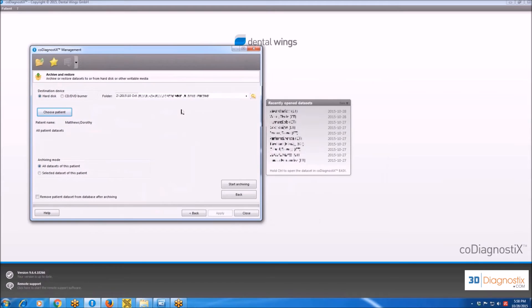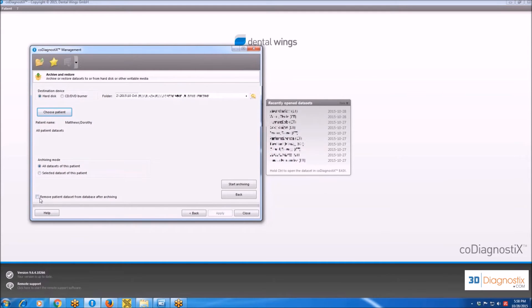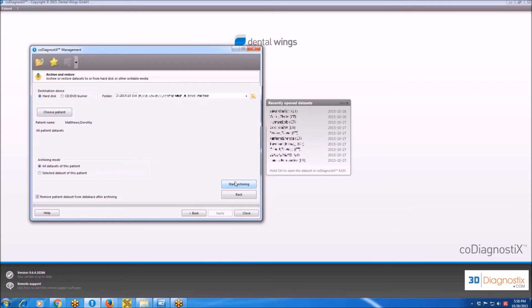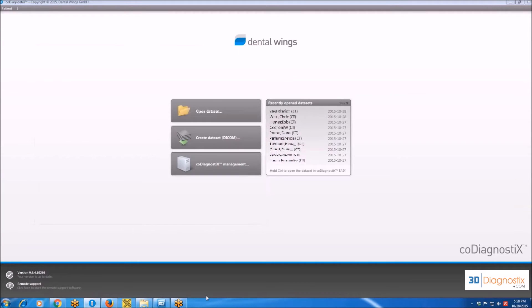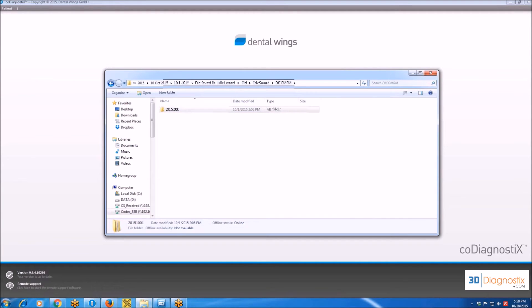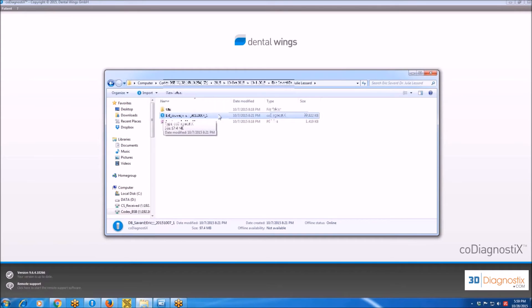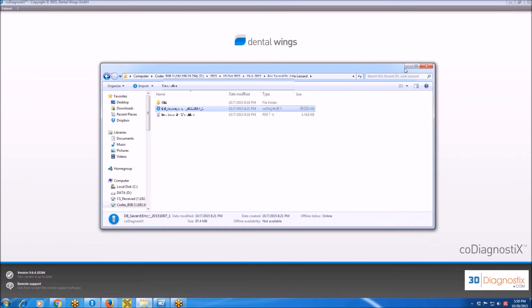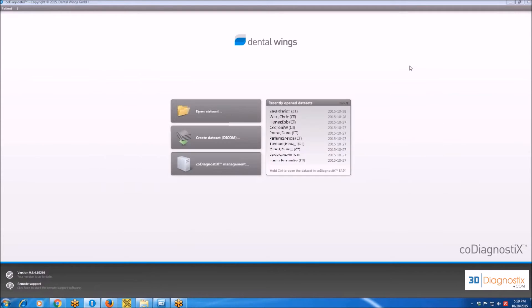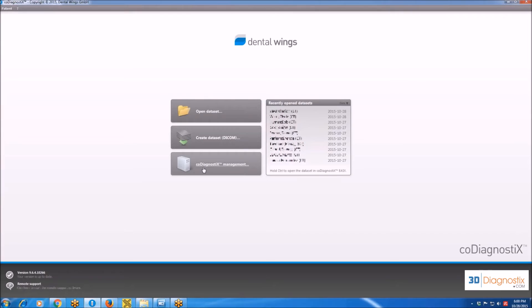Now we have two options: either save in a folder on the computer and keep it in the software, or, in order to remove this dataset from the software, just check this box at the bottom that says Remove Patient Dataset from the database after archiving, and then click Start Archiving. Once you archive to any folder, it's going to appear as a .caf or CAF file like this file over here: patient's name, Co-Diagnostics icon, and the extension of the file is .caf, which is Co-Diagnostics format. Let's say if you want to use the software on another computer, but you don't have the dataset saved on that other computer, you can save it to a USB stick or a CD-ROM and open it easily.